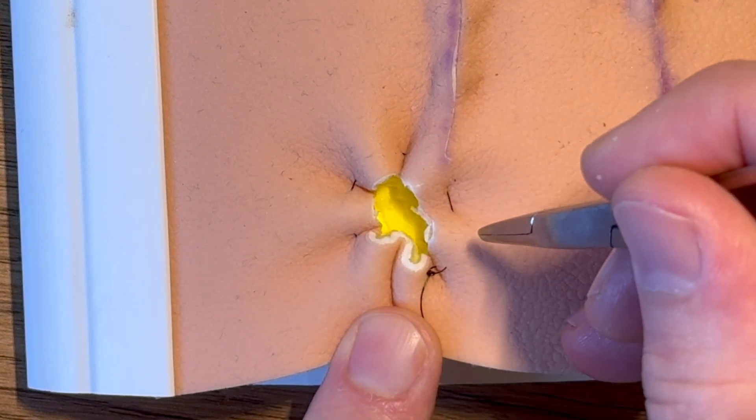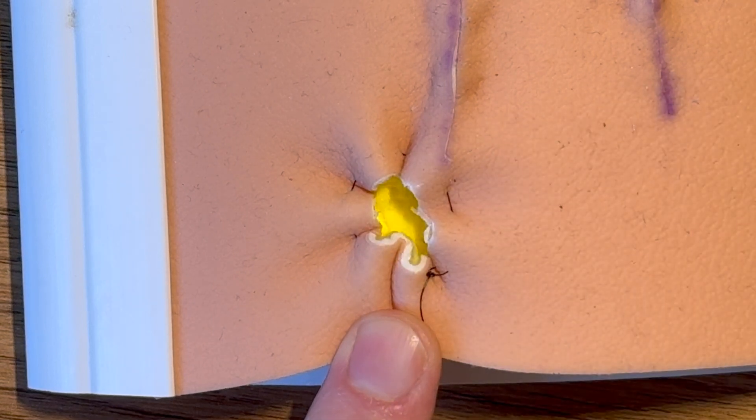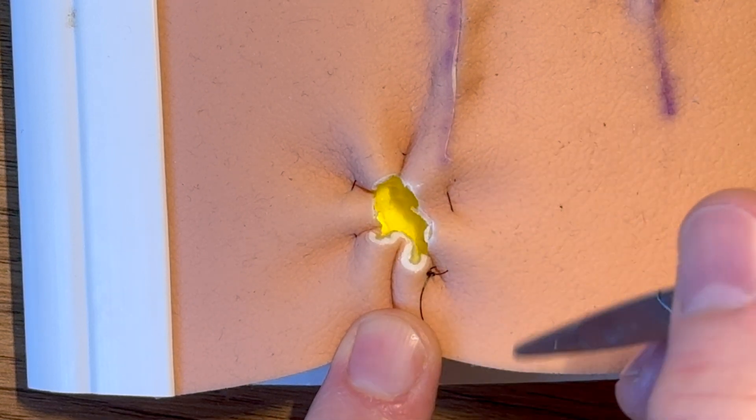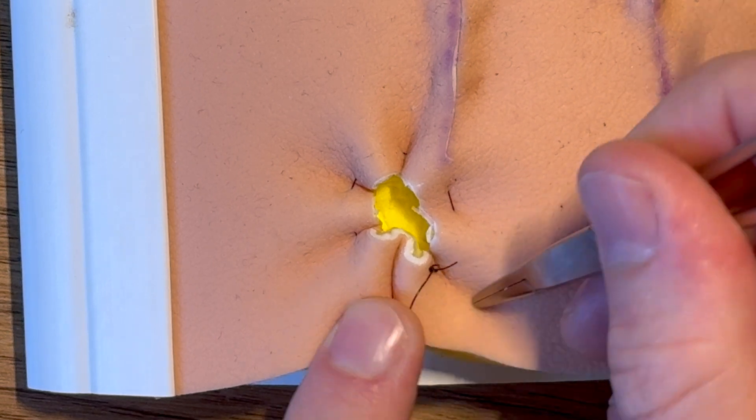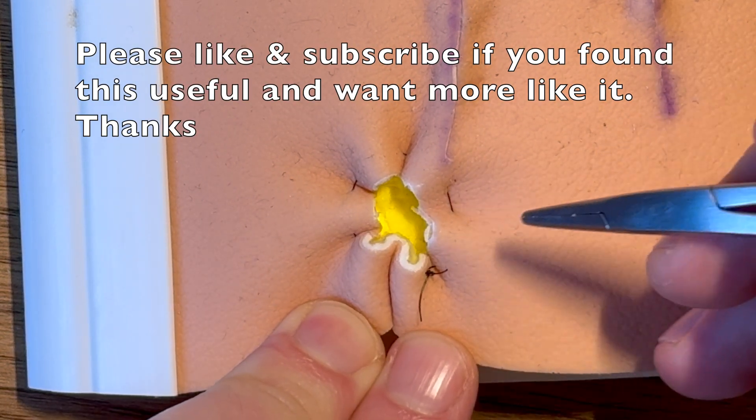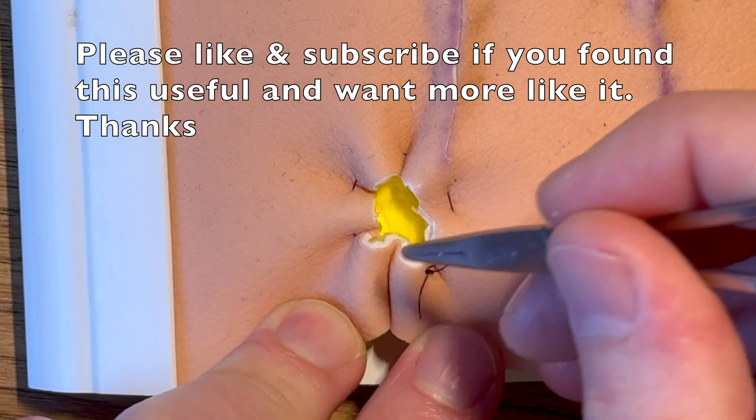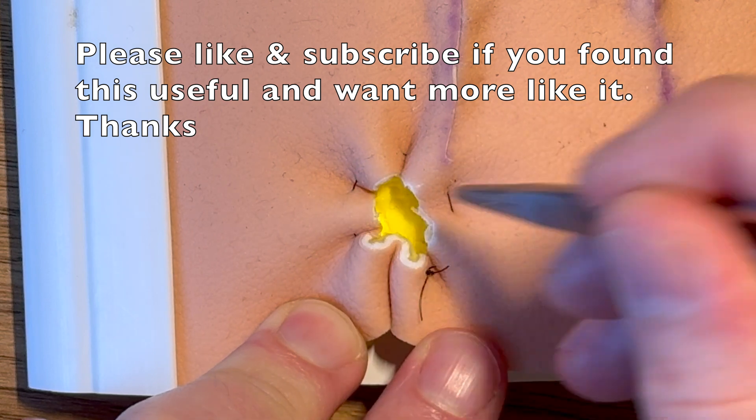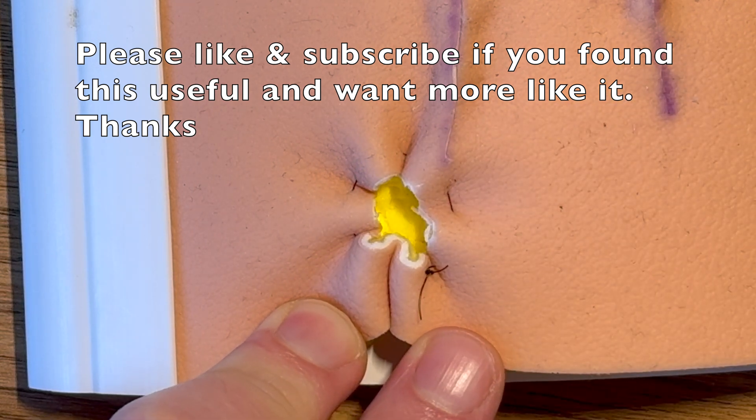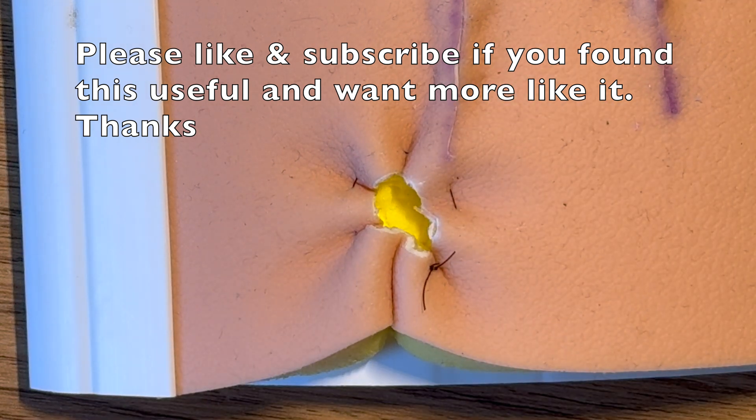But it is awkward to take the stitch out. You're going to have to snip it and then pull it through and it's going to be quite well attached by that stage so it's going to be uncomfortable for the patient. Plus it means they definitely have to have a health care visit to do that. So I in practice don't really use this, I tend to use the buried because there's no real reason not to except for when the skin is so fragile you can't get it to hold the buried stitch, and then you're going to need to perhaps resort to this at times.